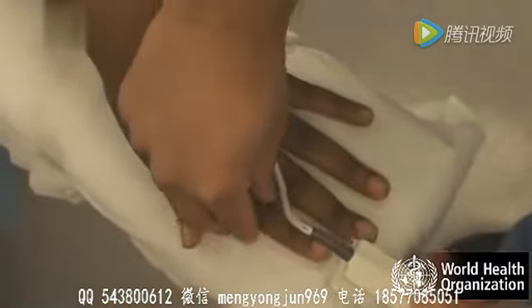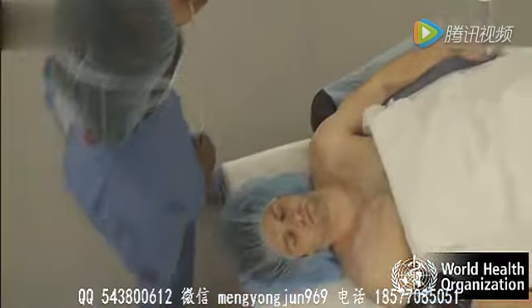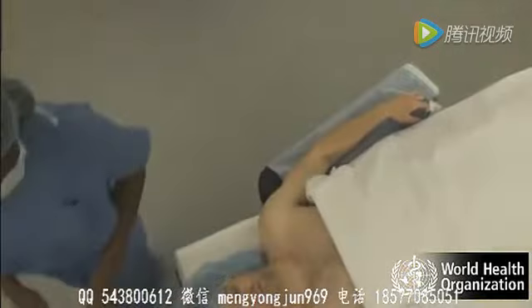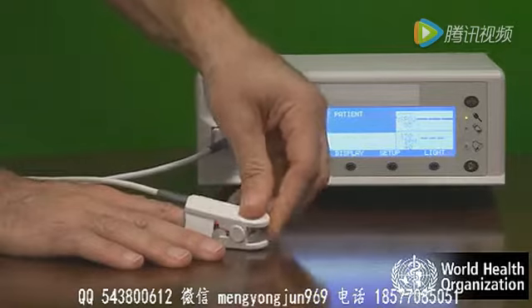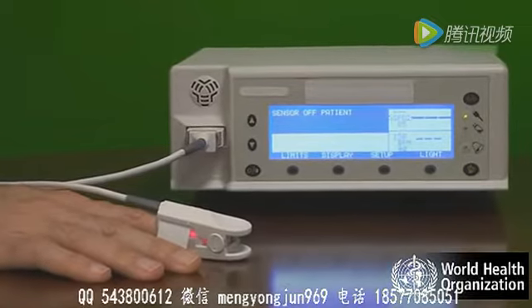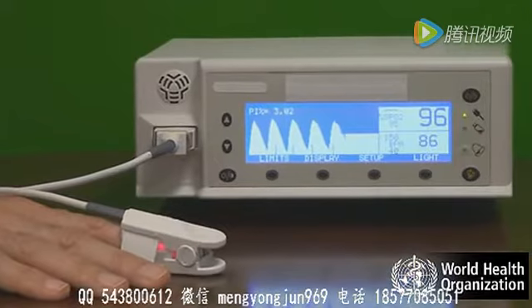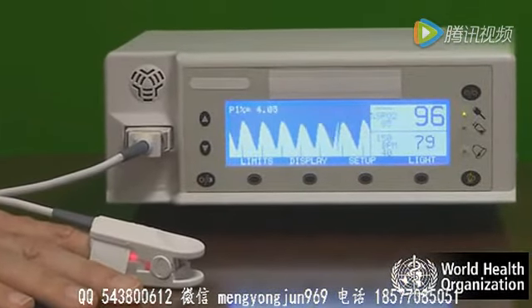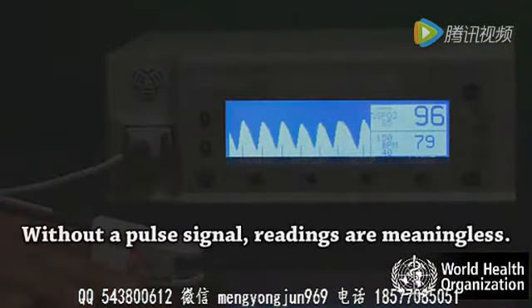Position the probe carefully. Make sure it fits easily without being too loose or too tight. Avoid placing the probe on the same arm as the blood pressure cuff. Allow several seconds for the pulse oximeter to detect the pulse and calculate the oxygen saturation. Look for the displayed pulse indicator to ensure that the machine has detected a pulse. Without a pulse signal, readings are meaningless.